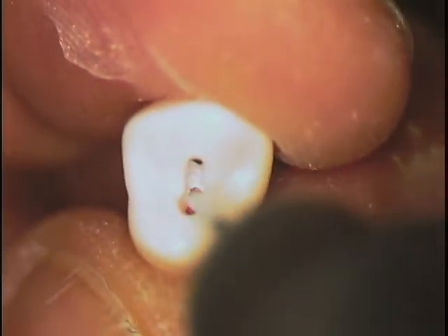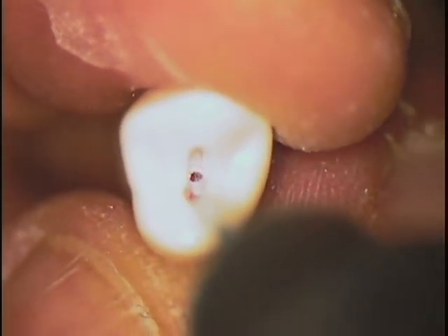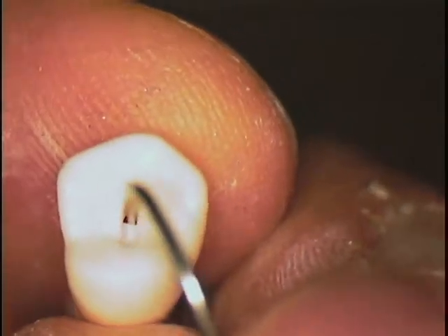And you'll think, well, is that the base of the root canal, or did I go far enough already, or is that the orifice? I would measure that. If you're about 6 millimeters, you still got a ways to go. And so that would be your, can I have another Explorer with a pigtail? So now you take out your regular Explorer, and on the end of it, let me have one more that has a little pigtail on the end of it. You get the one that has a little, and you start to feel the roof.